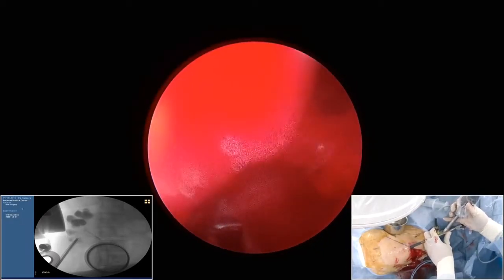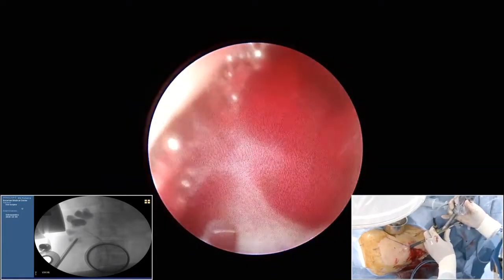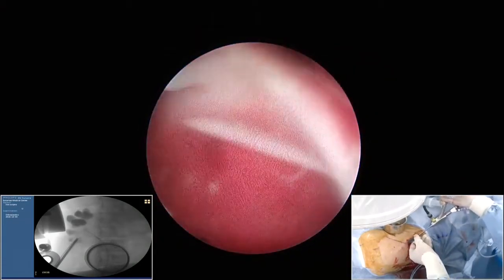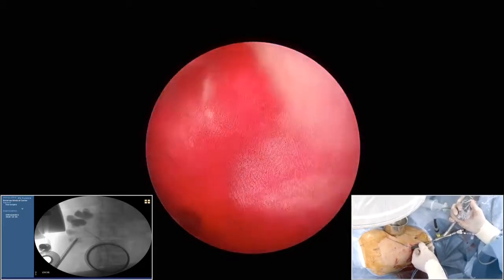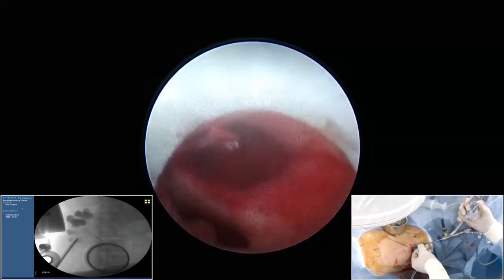So, okay. You would now normally go for flexible piloscopy, which you originally thought of. Is that right? Yeah, because of the angle, I cannot reach the mid-pole stone. So maybe this is my time to change the scope to the flexible cystoscope, nephroscope.